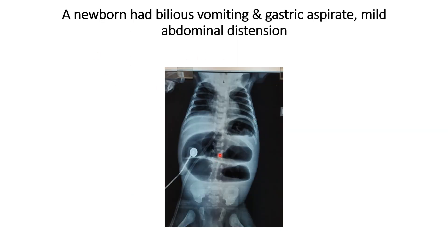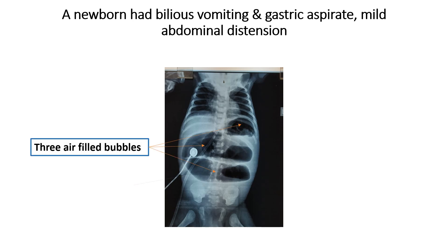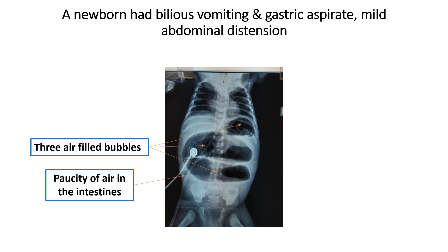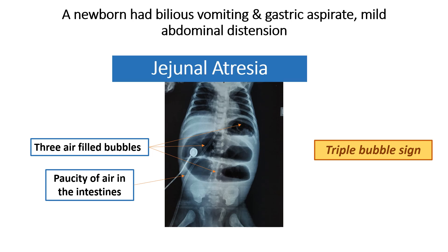This is the X-ray of a newborn who had bilious vomiting and gastric aspirate and mild abdominal distension. In this X-ray, you can see there are three air-filled bubbles visible: the first is the stomach, the second is the duodenum, and the third is the jejunal part. In the other part of the abdomen, there is no bowel gas visible, meaning there is complete obstruction beyond this point. The abnormal radiological finding is the triple bubble sign, and the diagnosis is jejunal atresia.